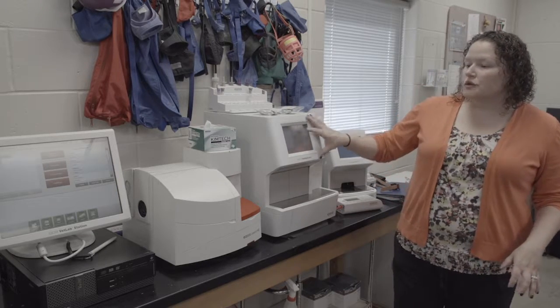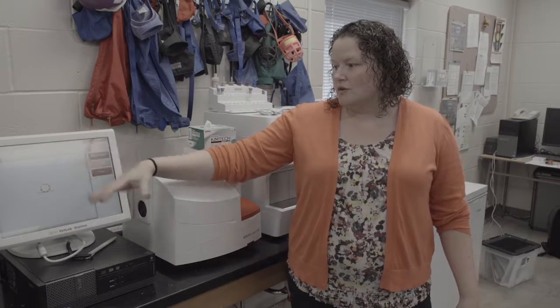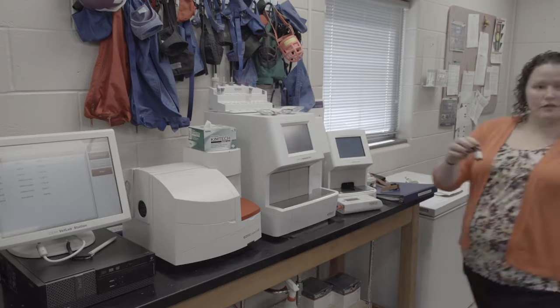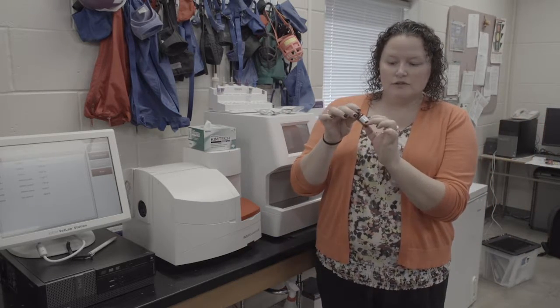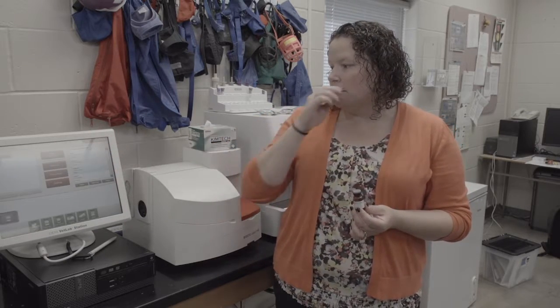Okay, so to run quality control, I am going to tap on my catalyst and tap on quality control. It will list all of the lot numbers of Vetrol that are available currently. Our lot number will be on the amber vial. This one says lot K4433. So we're going to find that lot number on here. We're going to tap on it and we're going to tap on Run QC.